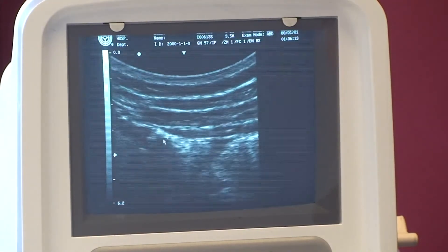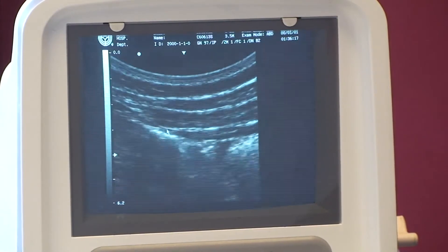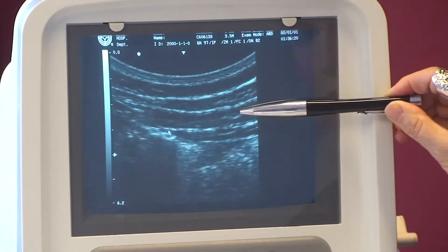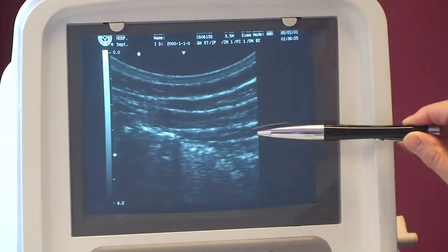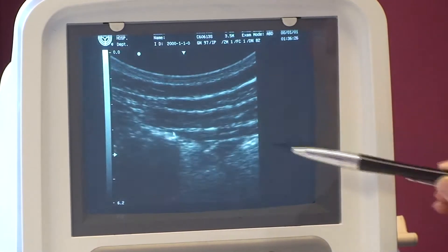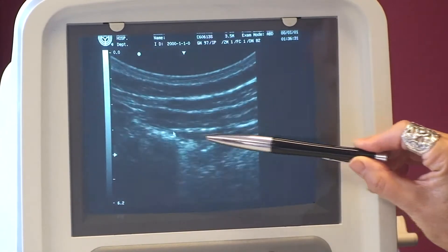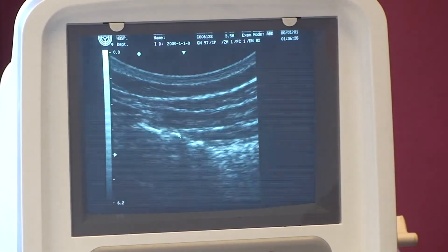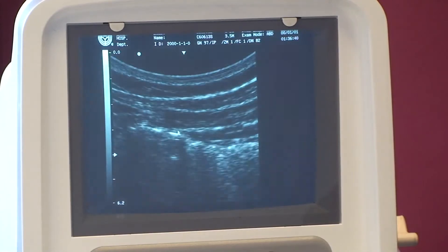We don't want that. When people have back pain, we see the top muscles brace first and some sleepiness or laziness in the transverse abdominus. So what we want to do this time is see if we can get Alex to isolate the transverse abdominus — you'll just get a little slide when you watch the screen. We haven't brought in pelvic floor instruction yet; we're simply looking at transverse abdominus for the moment.